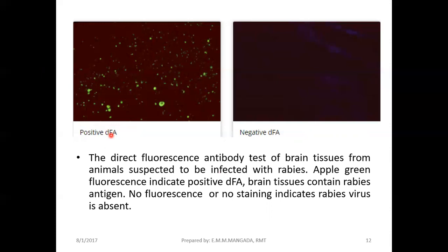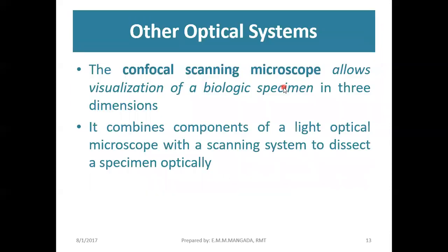And it's actually an antibody directed against the antigen. So dito sa example natin, since our antigen is rabies antigen, then the antibody that we use in detecting these rabies antigens are your anti-rabies antibodies, and they are labeled. Okay, so ang label nila ay yung inyong FITC or your fluorescein isothiocyanate. Okay, so that's for your fluorescence microscope and the application we have in your fluorescent assay.